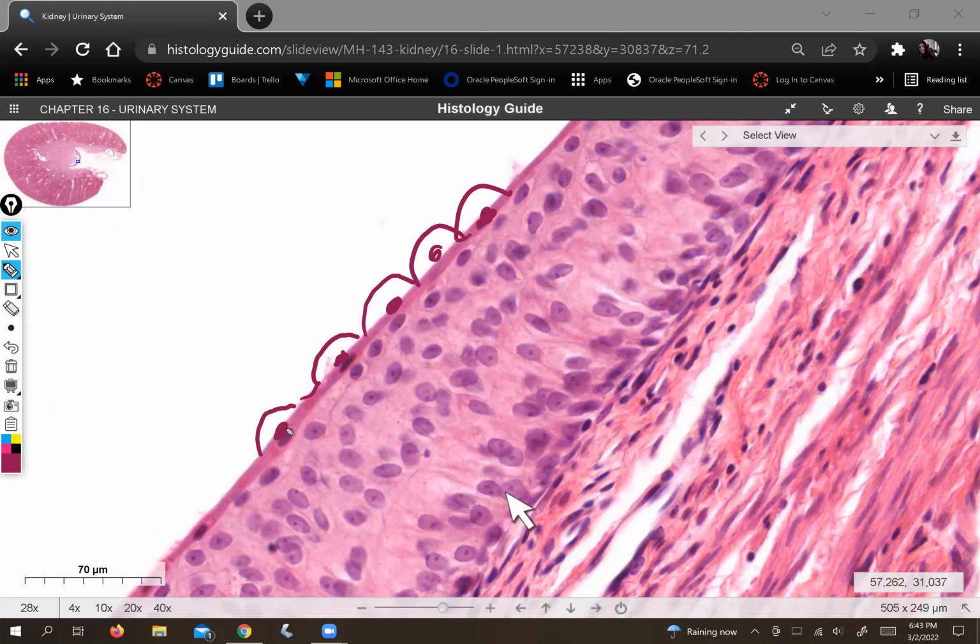It's like a scrunchie. Your scrunchie only has ruffles when it is relaxed. If you stretch it out to the max, the fabric is no longer wrinkled. So in this case, we have some stretched umbrella cells, which makes their task a little bit harder, but you can pay attention to the nuclear morphology, and that should fill in the rest of the confusion.